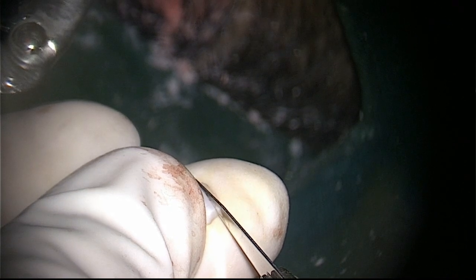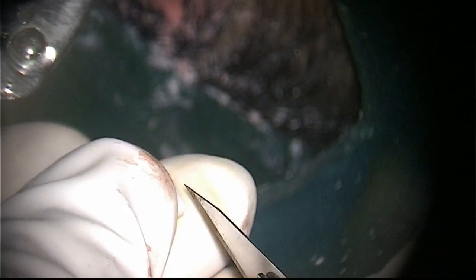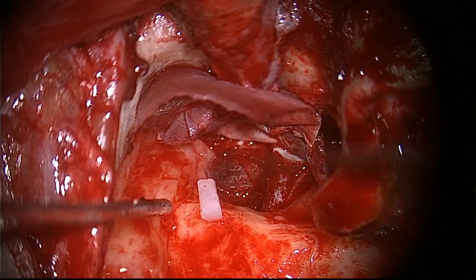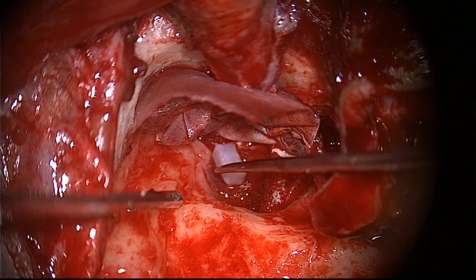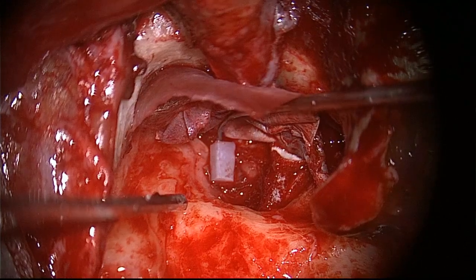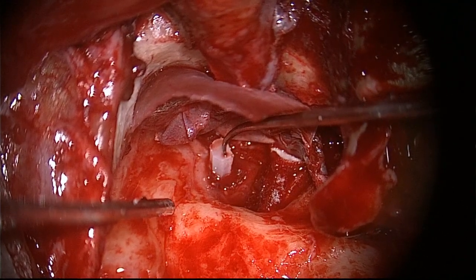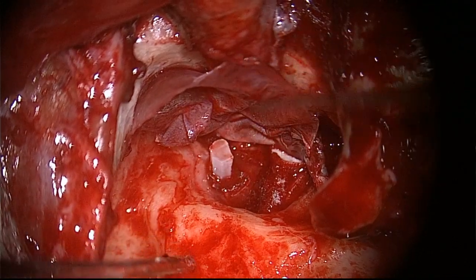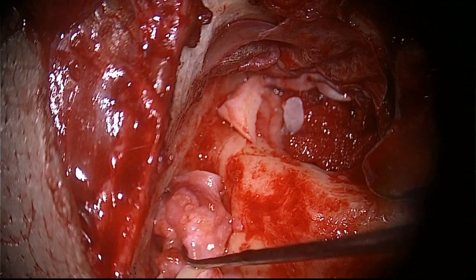So again, you see, this is a canal wall down technique where I am using a long columella technique. This is where I am using a septal spur cartilage which is preserved. All this septal spur cartilage and homograft ossicles are preserved in 70% alcohol. And see, a small piece of temporalis fascia is kept on the footplate, and now I am making the cartilage sit. This is nicely fitting there, and we need to increase the mid-ear height there.